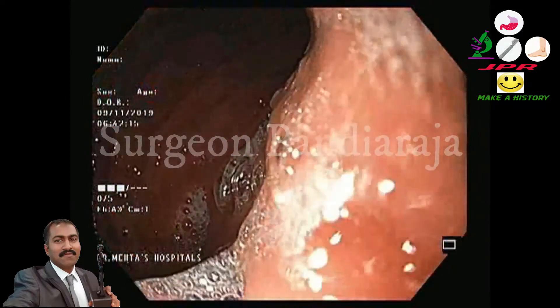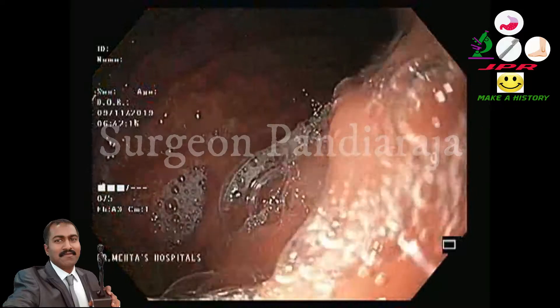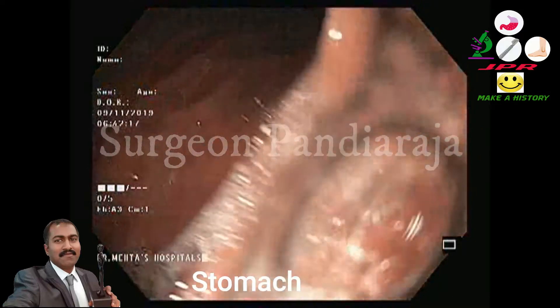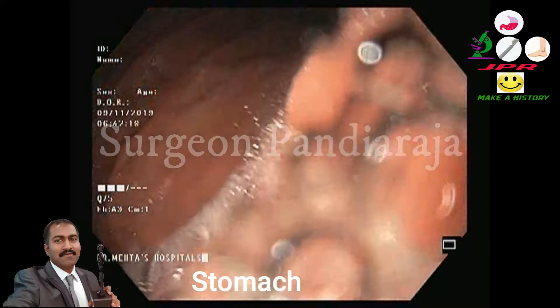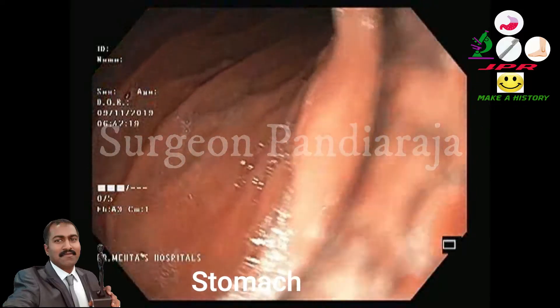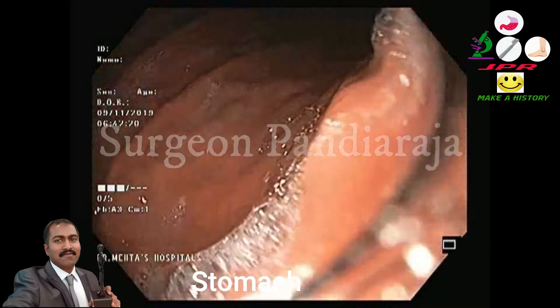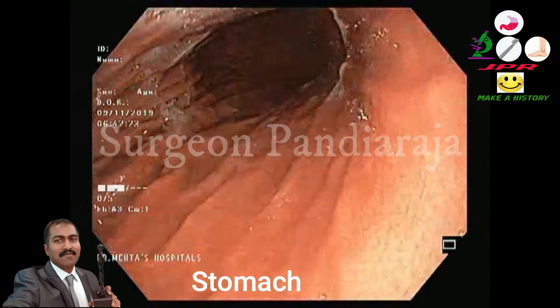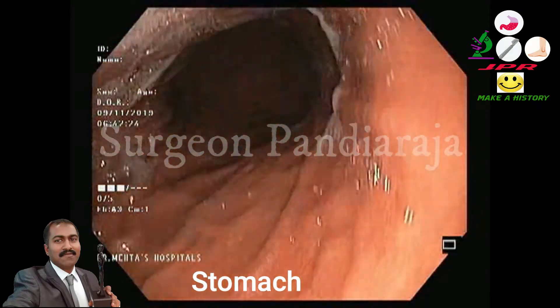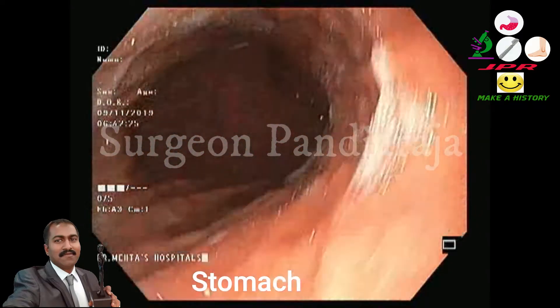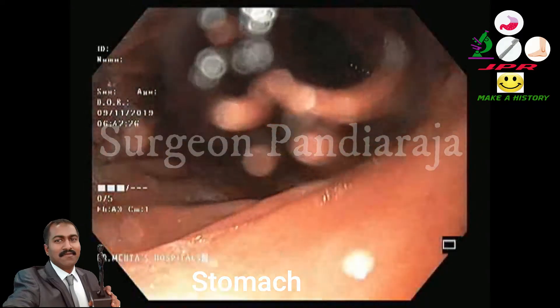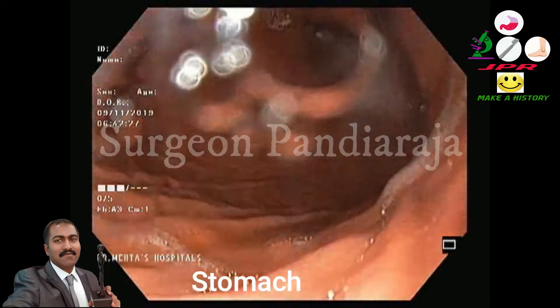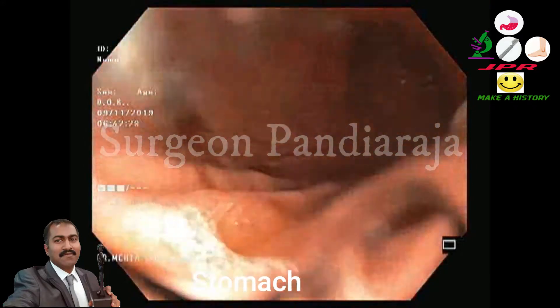Now the scope is advanced into the stomach. Inside the stomach, we will look for any lesion, such as inflammatory lesion, mass, and mucosal pattern, muscularity, etc.